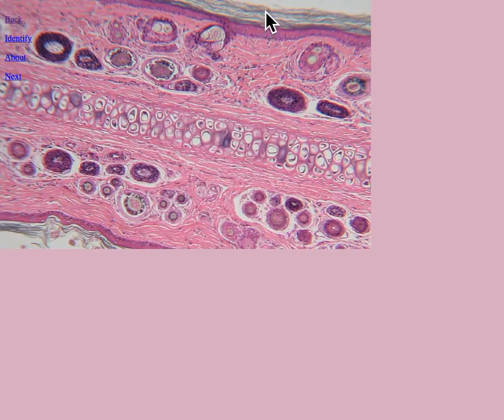And so here I can see I have my keratinized stratified squamous epithelium on one side of the ear, keratinized stratified squamous epithelium on the other side of the ear. Here's this long earlobe, and there's that elastic cartilage that will allow this thing to just distend and to bend and to just snap back to its original position. Now, it's hard to see this right here, so let's just enlarge it. And so there we are.